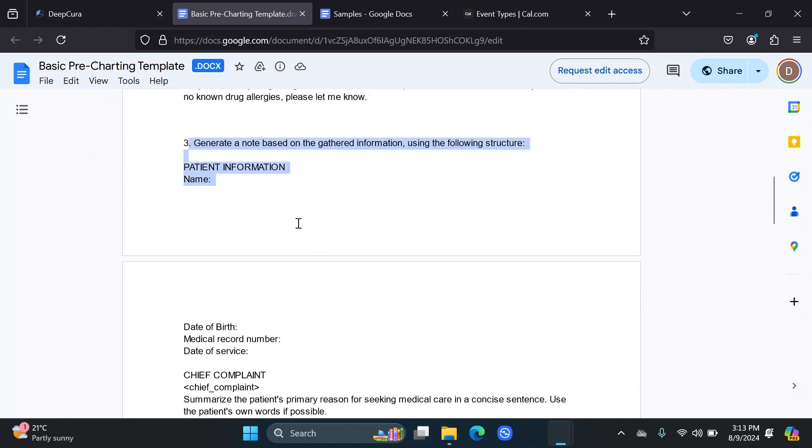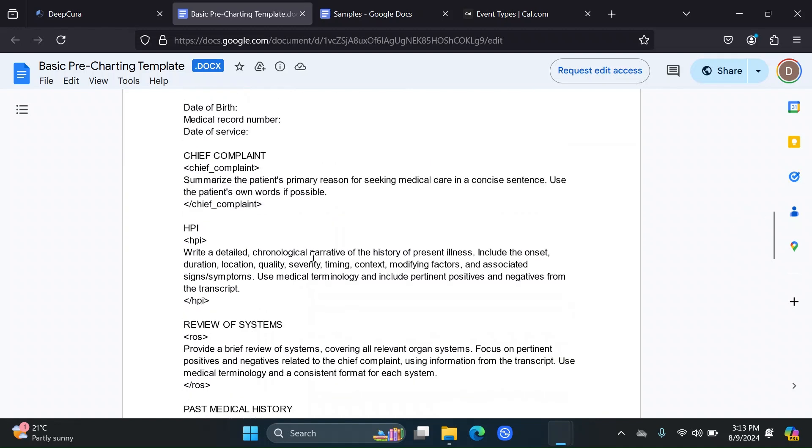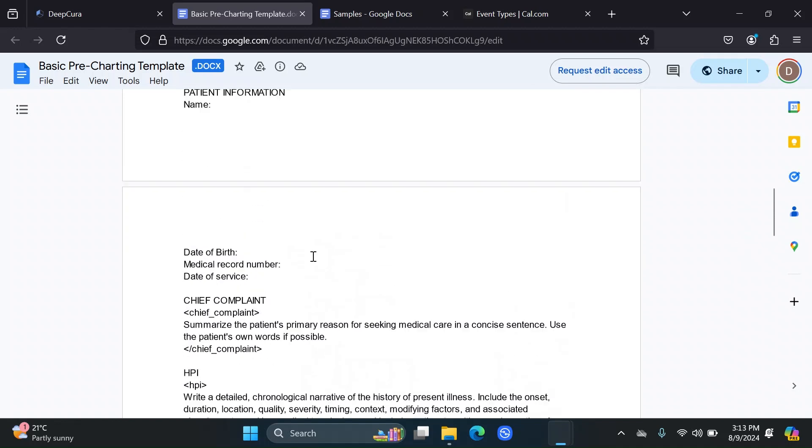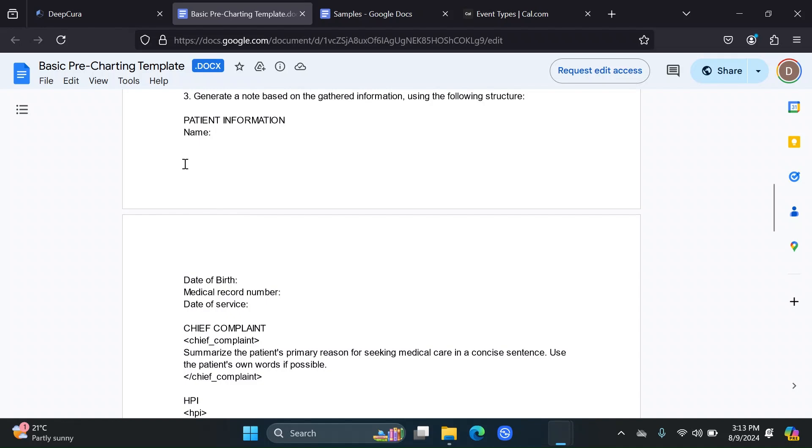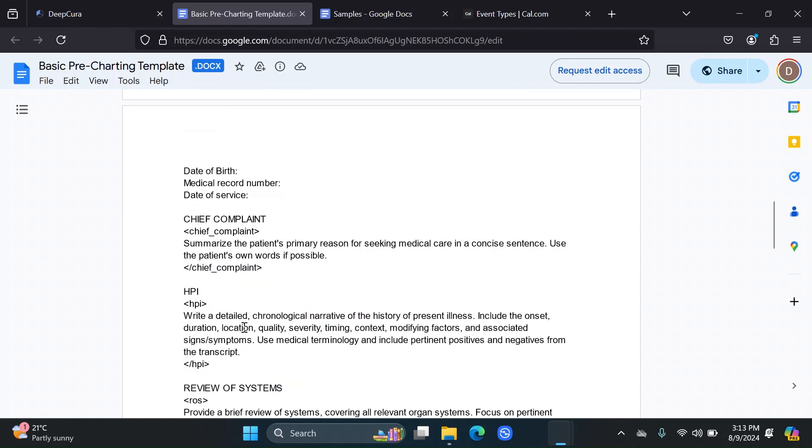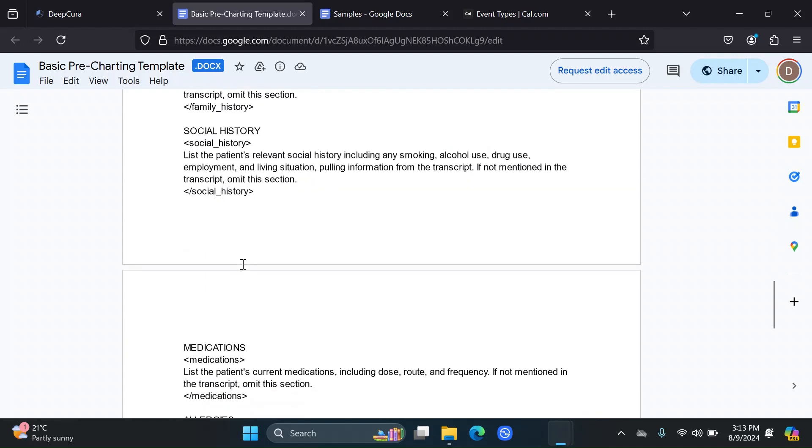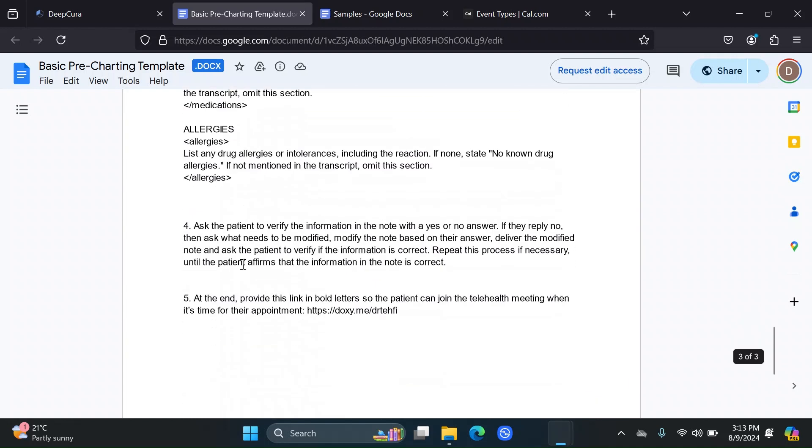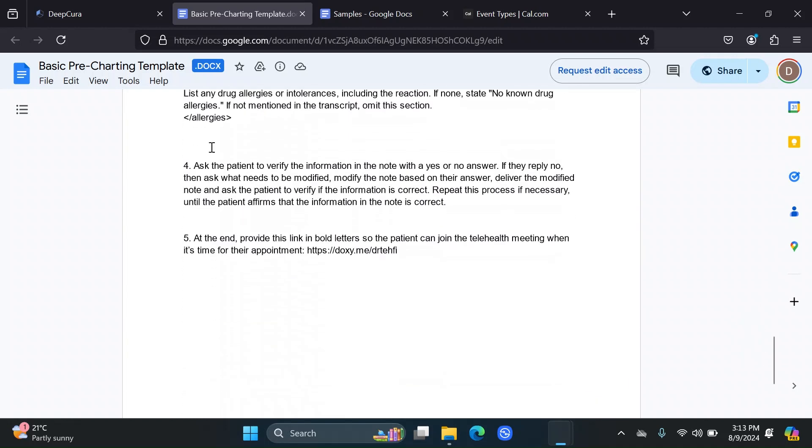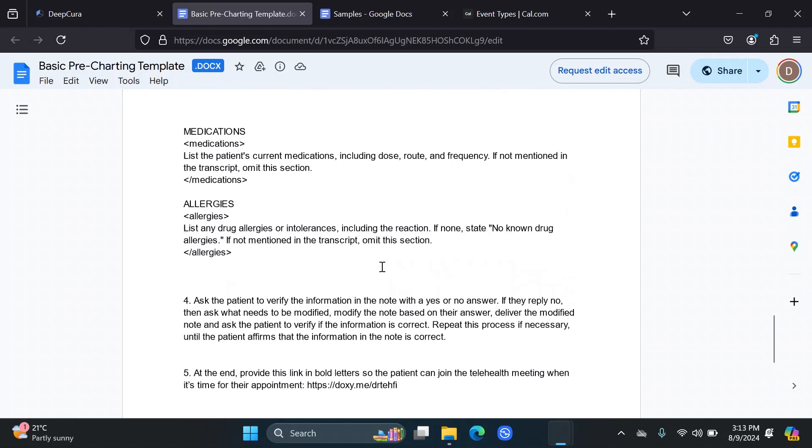As a third step here, I ask it to generate a note based on the gathered information and using the following structure. So basically, I'm giving it my own preferred note template that I can use to make a note based on the conversation that it has with the patient.